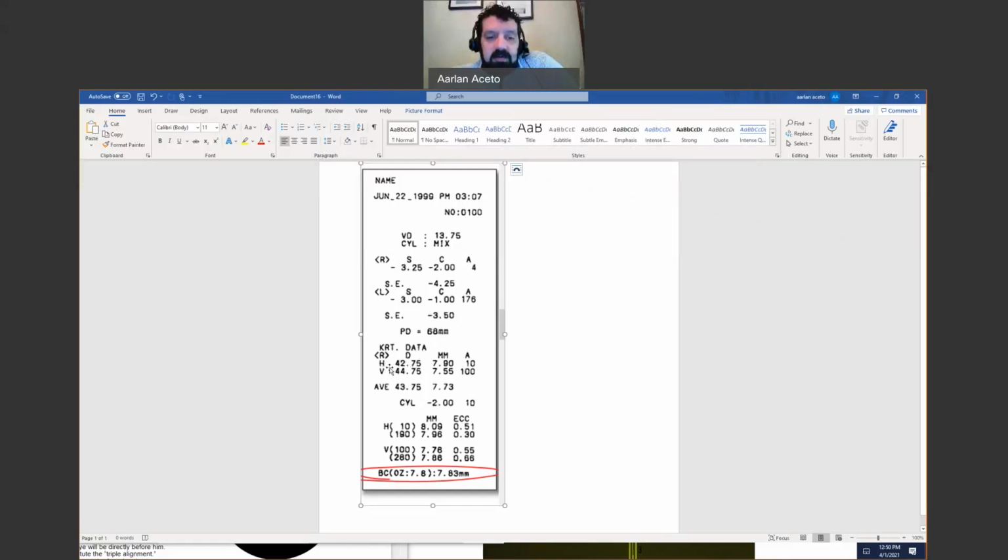But in this case, what I want you to realize is, one, it was done automatically by a machine. We didn't have to twist any dials. We just pushed a button. Secondly, if you look at this, I can tell that at 10 degrees, this person's cornea has a certain curvature, and then up and down at 100 degrees, it has a steeper curvature. They're not the same. One refracts better than the other. And this is what an auto keratometry is.